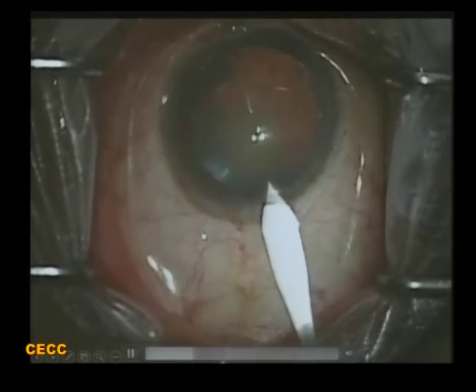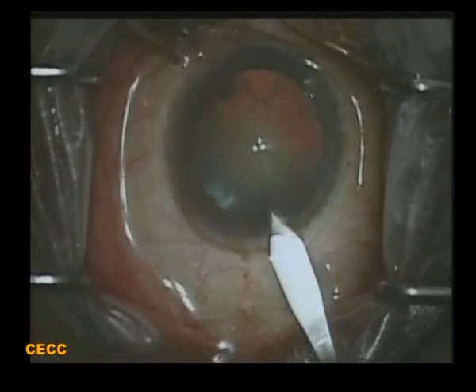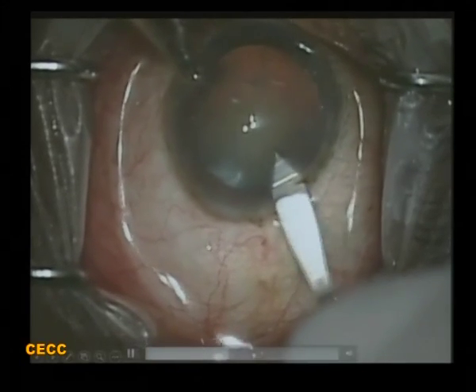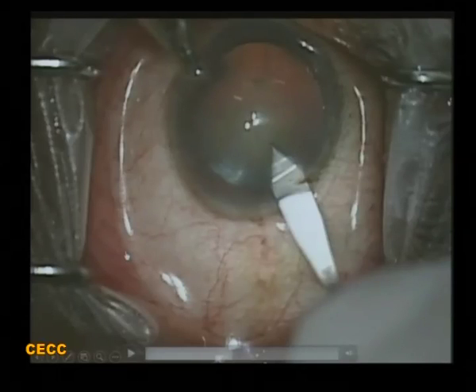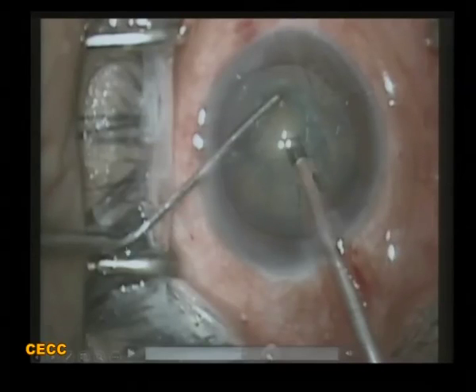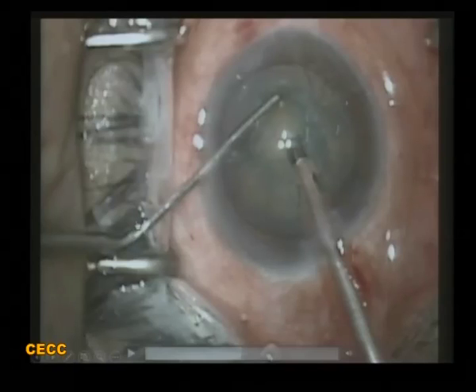We see the eye is diverted towards the nasal side and we are not able to enter the entire chamber. The conjunctiva is getting torn, and this usually happens when we are using blades which have been used before in multiple cases. Because patients are poor and non-affording, trainees often get these blades, and they can cause rupture of the anterior capsule.